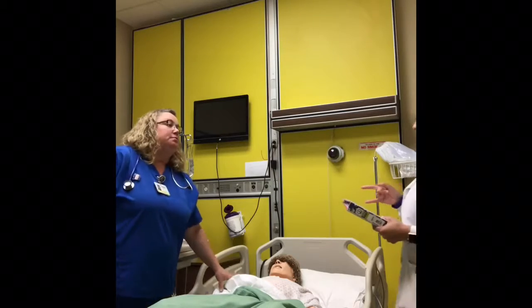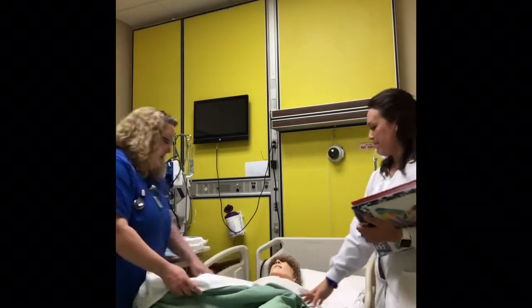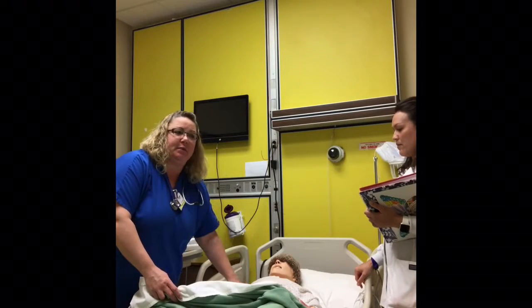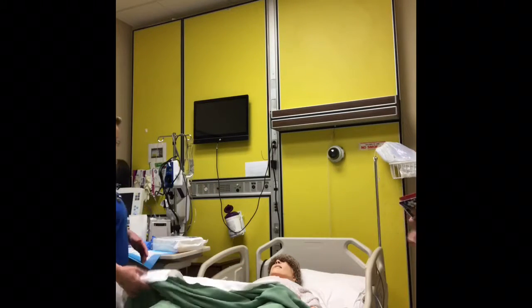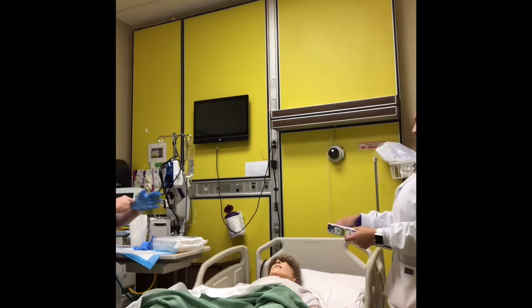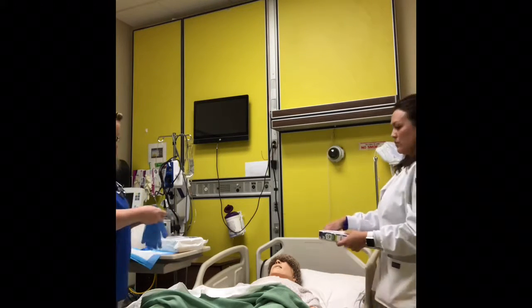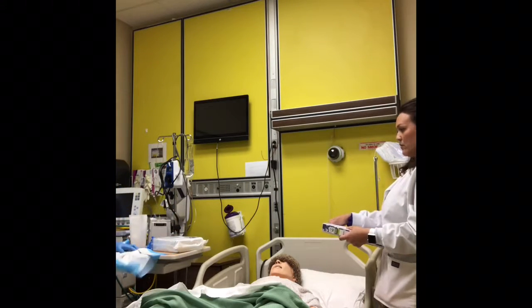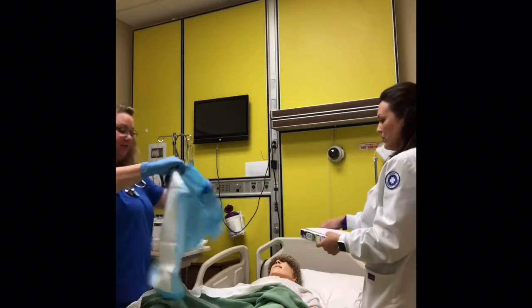Okay. So now apply clean gloves. First we're going to palpate the bladder for distension. In this particular patient, we already did a bladder scan and noted that the bladder was full and needed to be catheterized. This patient is not that clean, so before we start any part of the sterile procedure, I know from school that we are supposed to clean them. Make sure that the vagina or penis is free of debris.